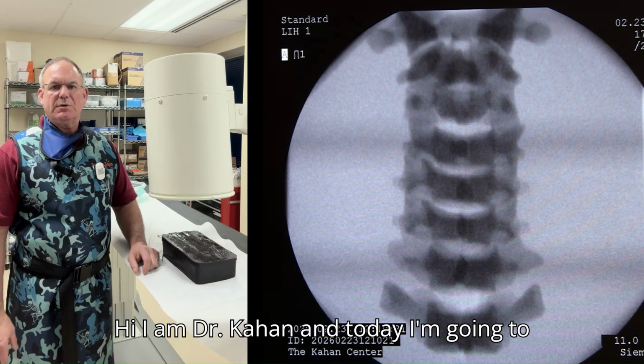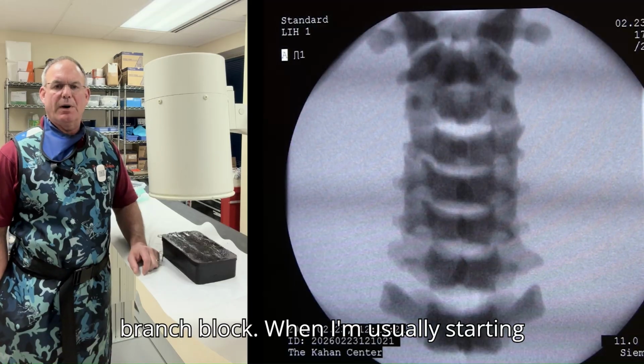Kahan, and today I'm going to demonstrate how to perform a medial branch block.